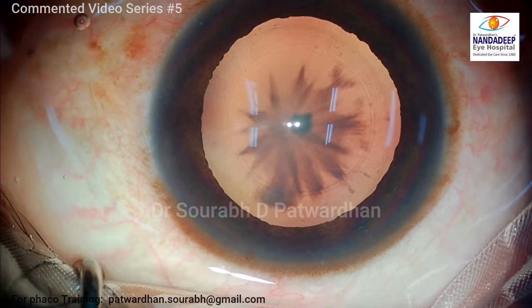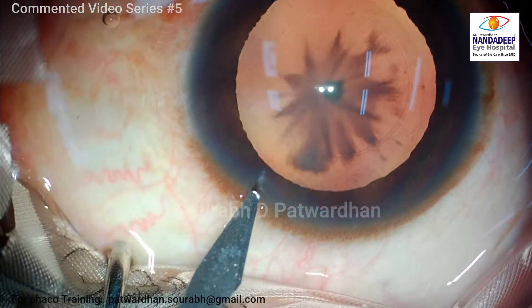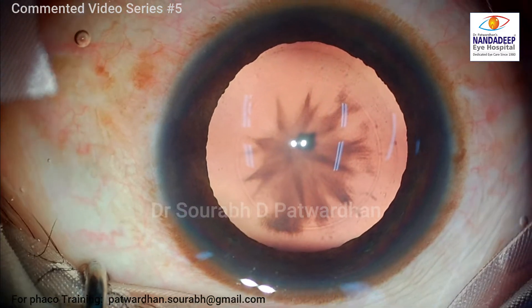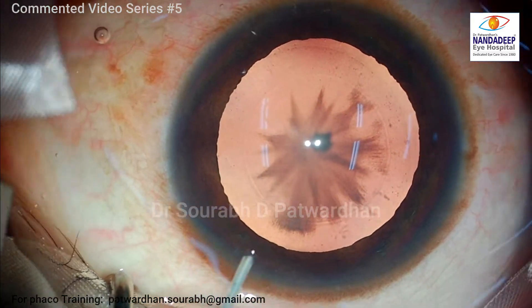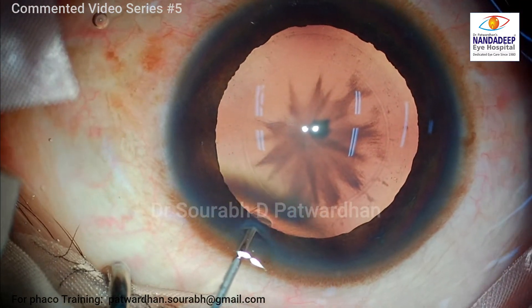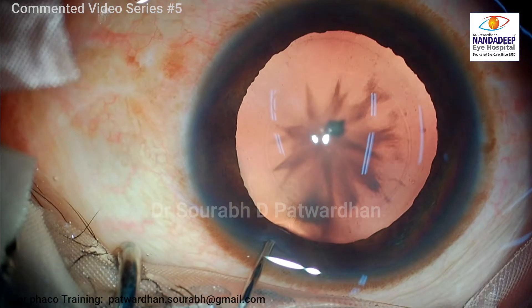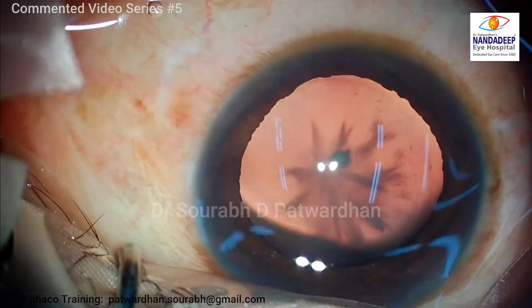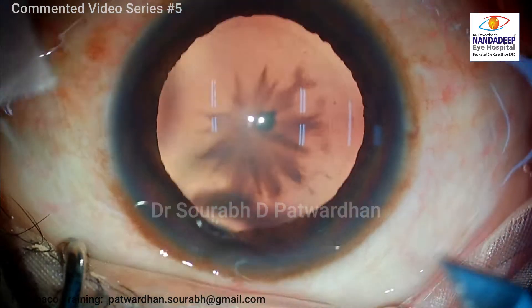I am using a CCC marker — a slightly smaller marker of 5 mm. I want to make a good central capsulorhexis for this patient so that the eye stays good for long years ahead. I will be using some intracameral xylocaine as well. This xylocaine is without preservatives, so it is safe for the endothelium.